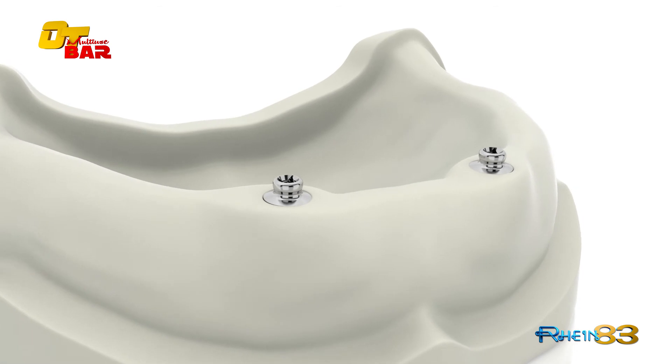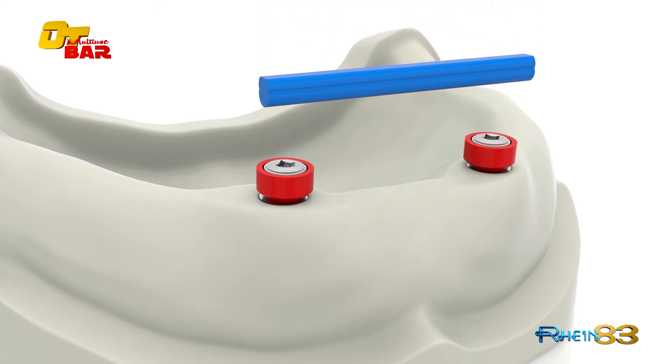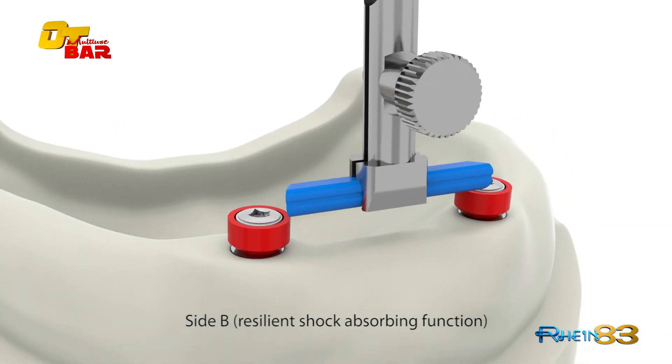Position the castable cylinder for the Seager bar and fix it with the titanium self-extracting screw with peak ring. Position the OT bar with the mandrel. In this case, side B has been chosen, which allows a resilient shock-absorbing function.